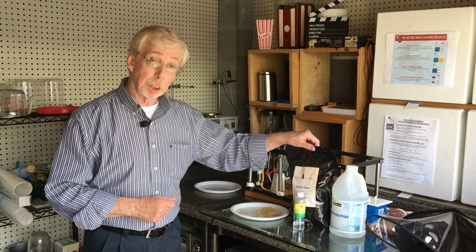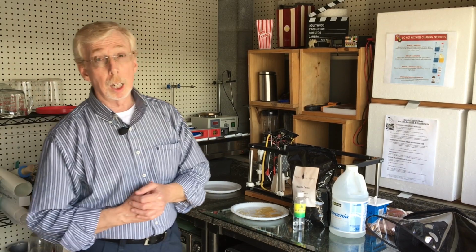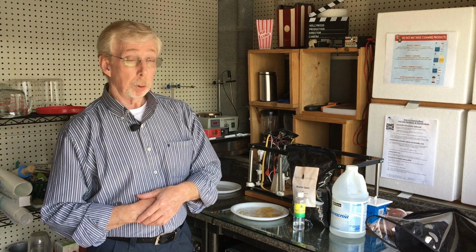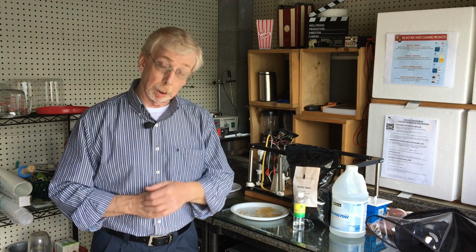And again, I'm going to use just powdered casein. That's a bodybuilder supplement. Find it online. It's a milk protein, casein. Just regular household ammonia. And before I pour, we're going to add some glycerin and stir that a bit. This chemistry takes about 24 hours. So patience with this project here.